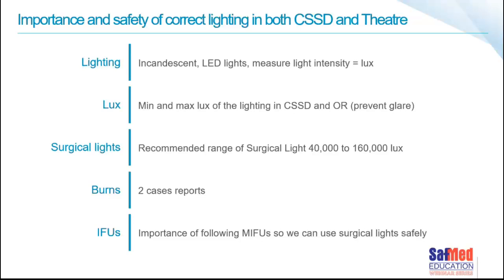Now, we haven't gone into any details on the important features that we would look out for in a surgical light, such as color rendering index and color temperature. We haven't at all covered the importance of the design of the light head and whether or not it's going to impede the laminar flow, and how manufacturers test the turbulence of air when they're designing their light heads. We haven't covered the importance of cleaning the surgical lights, or the role that a light could play in the transmission of disease, because there are a few published papers on that already. So having said that, I think it's certainly something that we would like to create another webinar about.